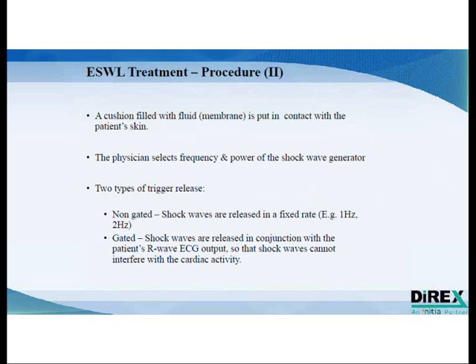The membrane is filled with water and then placed against the patient. There is a contact gel which allows you to avoid air bubbles and air pockets between the membrane and the patient's skin, and ultrasound gel is usually used for this application. And then you're able to generate shockwaves from inside the membrane and transmit the energy inside the patient's body. You can couple the patient using gated and non-gated shockwave in order to adapt to the cardiac rhythm of the patient.